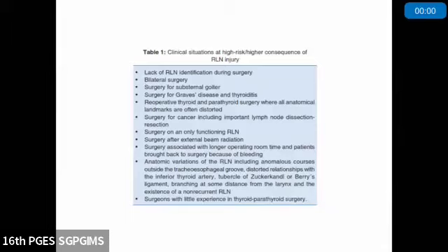As I mentioned, there are high-risk situations, where you're doing a thyroid surgery for cancer, a large goiter, Graves' disease, or a reoperative surgery. But I am a proponent of doing neuromonitoring in all settings because every thyroid is difficult. As Ashok Shah famously said, every thyroid is difficult, so you have to go with that mindset and have neuromonitoring in place. If you get an anatomical variation, and if you have neuromonitoring in place, you can very well save your nerves.